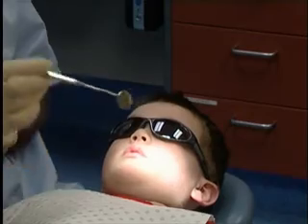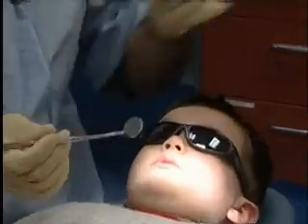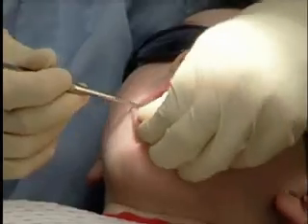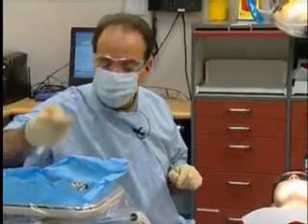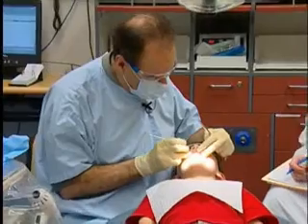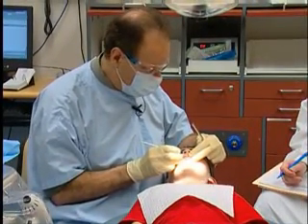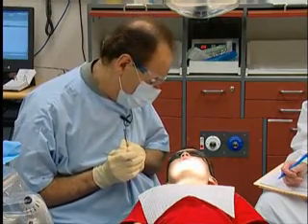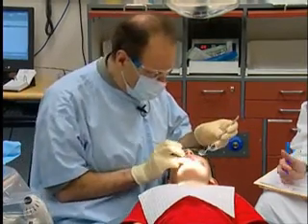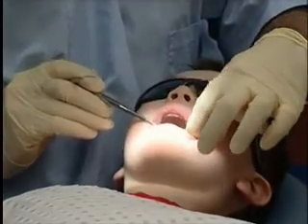Okay, good. Well, what I'm going to do, I'm going to use this mirror to have a look at your teeth, okay? So open for me, let's have a look. I'm going to use this little scratchy thing, and I'm going to scratch on your teeth like this. I'll show you. Can you feel that? Can you feel me scratching there? Okay. So I'm going to just scratch with that around your teeth, alright? Just to make sure that there's no germs hiding in any of your teeth, alright?